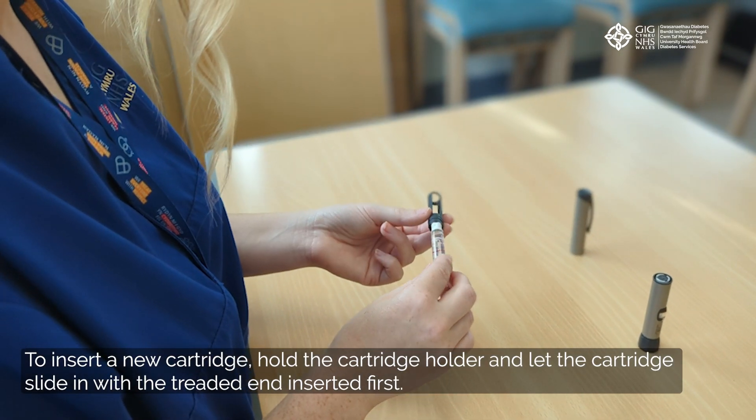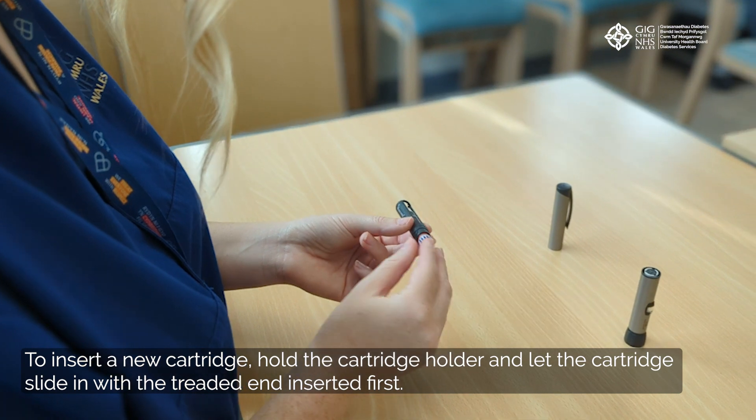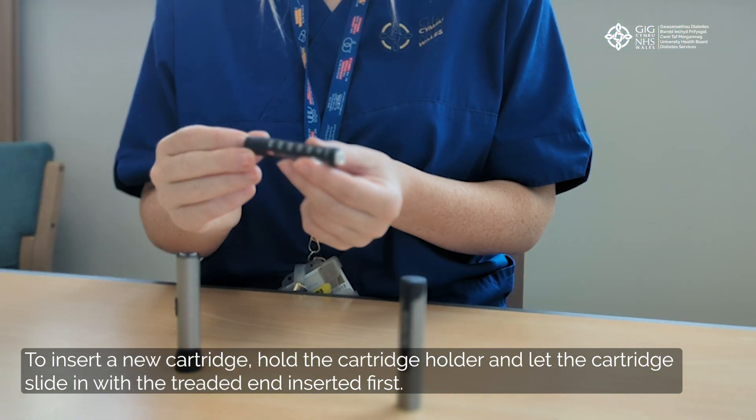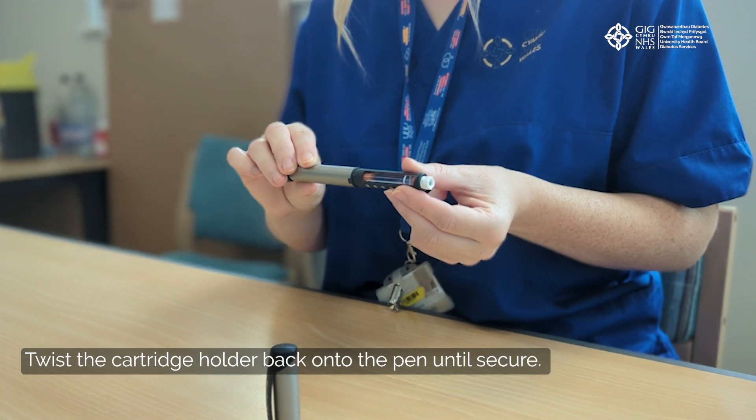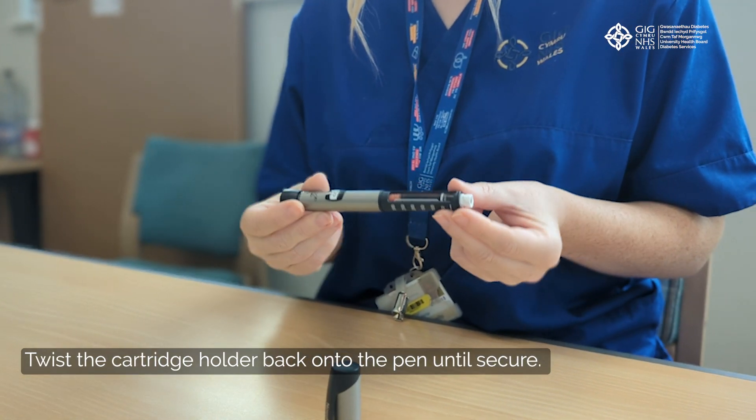To insert a new cartridge, hold the cartridge holder and let the cartridge slide in with the threaded end inserted first. Twist the cartridge holder back onto the pen until secure.